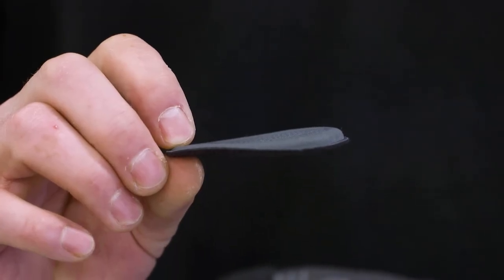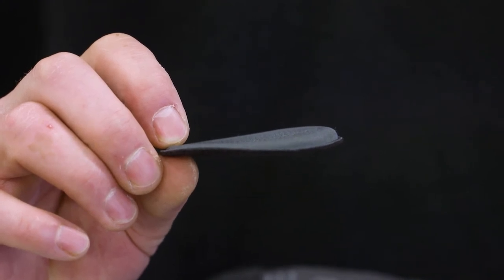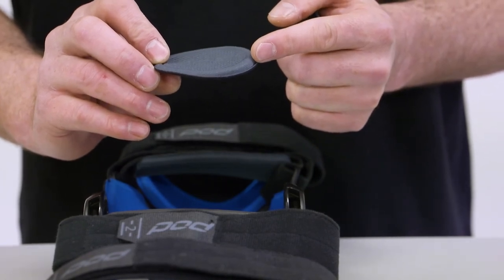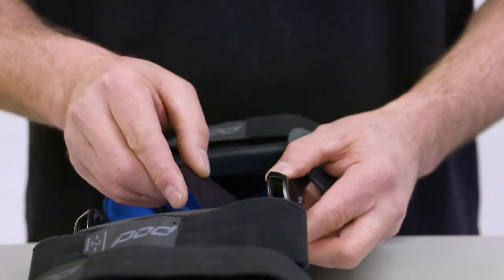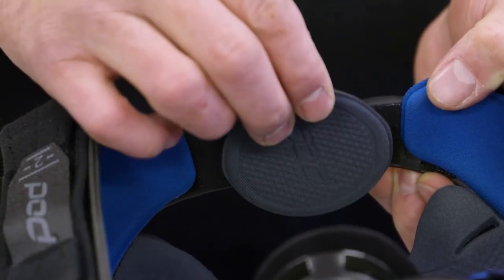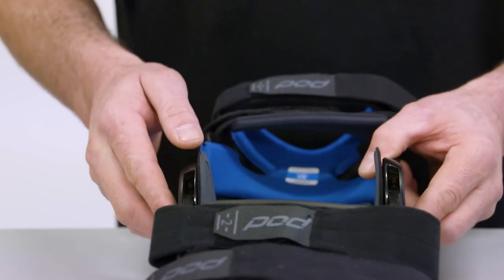We're putting the grey-thin pads into this K8 knee brace today. Each hinge pad has a thicker part and tapers off to a thinner part at the back. The thicker part goes at the front of the brace, on the patella side, tapering off toward the back of your knee. So ultimately, you'll have more support toward the front of your knee.